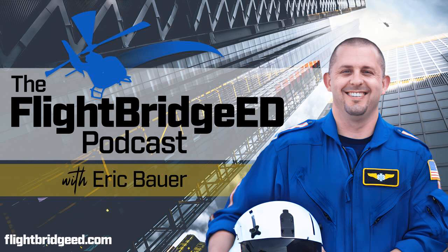A bundle branch block is a conduction delay in which there's a delay or obstruction along the pathway. This electrical impulse travels down and makes a heartbeat, and this delay or blockage that may occur on this pathway sends an electrical impulse to the left or right side of the heart, and it's delayed, and so it causes an abnormal beat, and that's where we have this identification of a bundle branch block. It's very difficult to determine if the patient with a left bundle branch block or right bundle branch block has an acute myocardial infarction, so that's why we're discussing this.